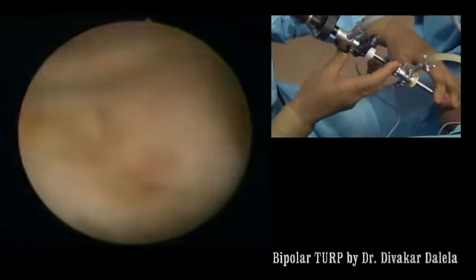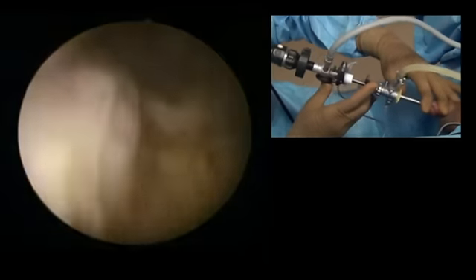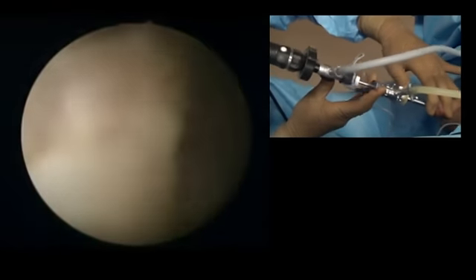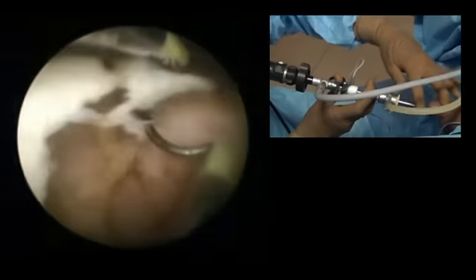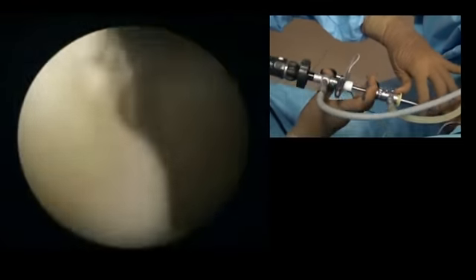As I mentioned, this is not a big gland, but the patient is having obstruction because of the peculiar anatomy of the gland, I guess. Now we are making finishing touches on the right lobe. I like to do finishing touches later on, not in the beginning, because if you open a sinus and start bleeding it hampers your vision.